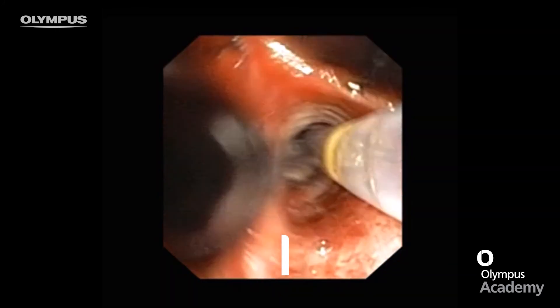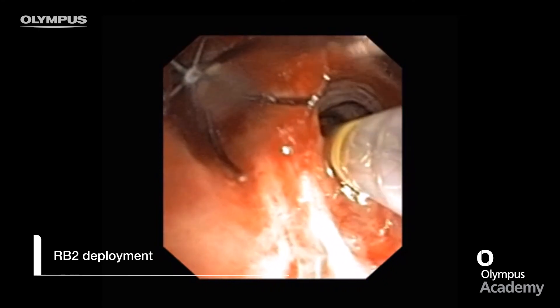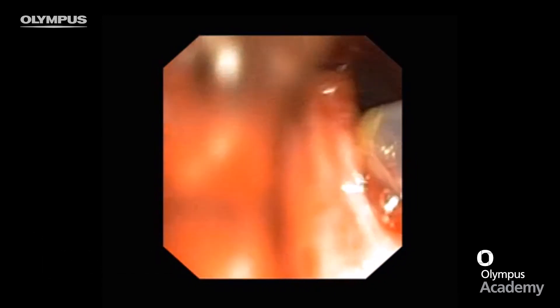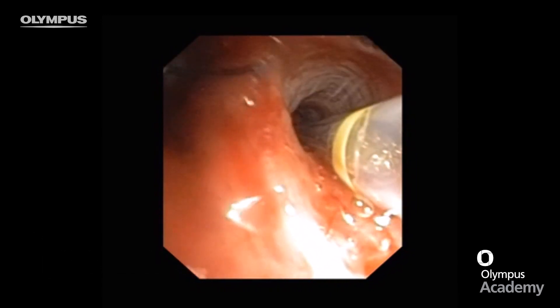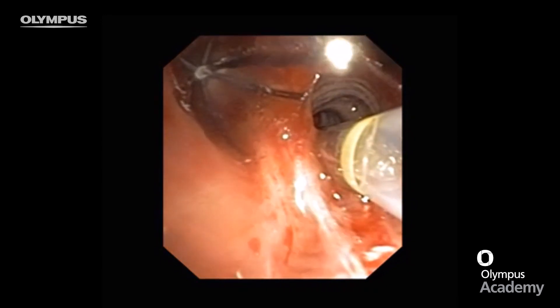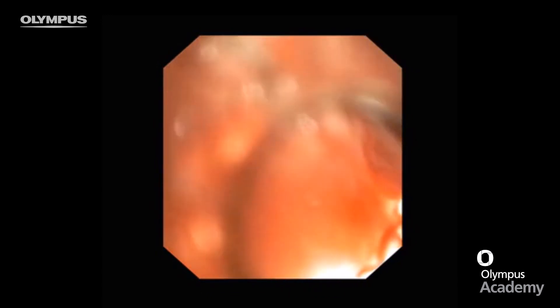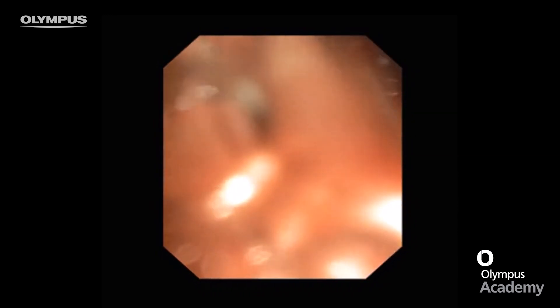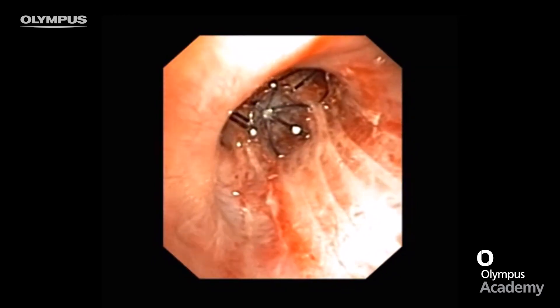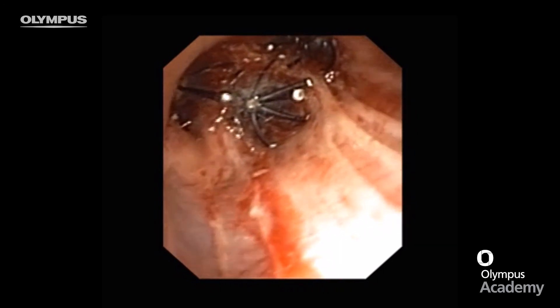I then deploy a size 6 valve into the remaining segment of the right upper lobe, RB2. The catheter is placed with the yellow mark at the level of the sub-carina and the valve is deployed without any issues. The valves are now securely in place and well positioned, with no gaps identifiable around the valve umbrellas and the walls of the airways.